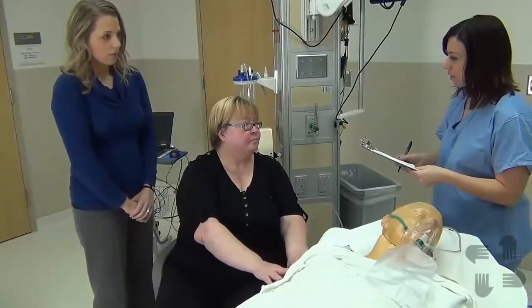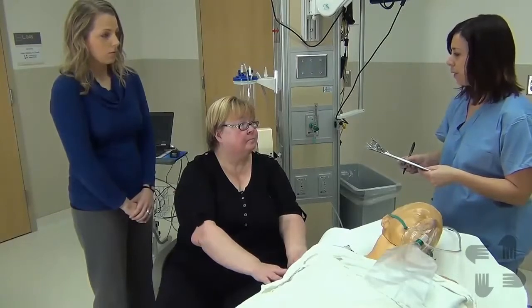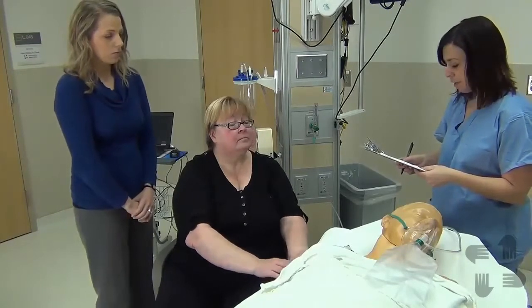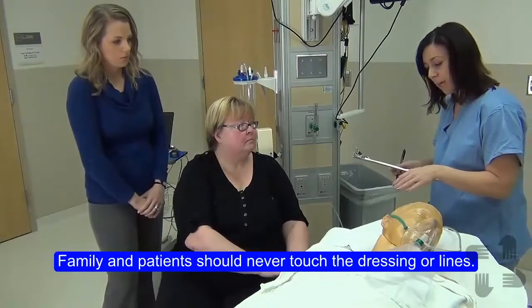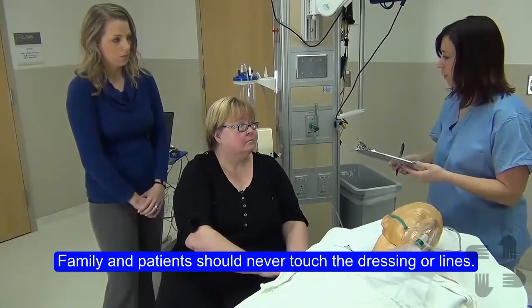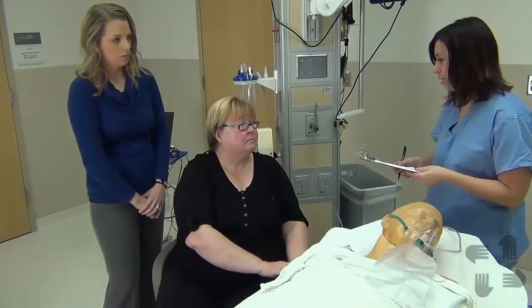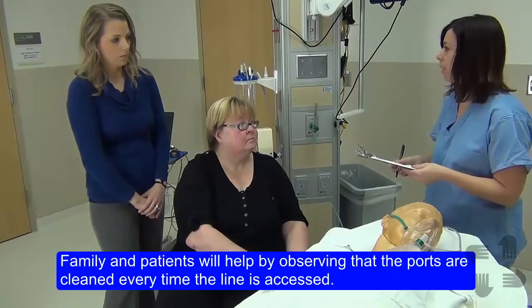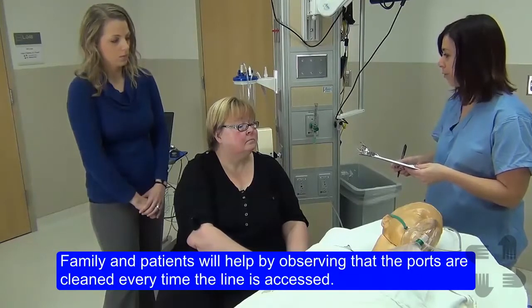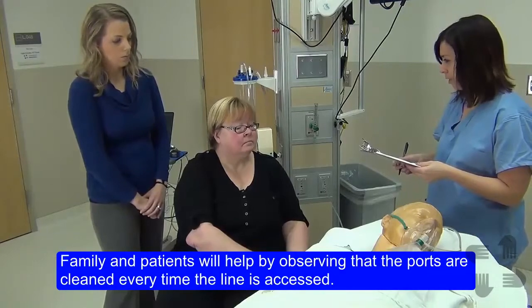Well, now that we've finished with the consent for George's line, I wanted to talk with you a little bit about what we're doing to help prevent infection with this line. And so first and foremost, after the line gets put in here on his neck, we'd like that all of the family members keep their hands away from it and actually not touch it. Our nurses, with fluids in, they're going to be putting an alcohol prep and a cleansing prep on there every time before entering the line so that we can help prevent infection. Any questions on that? Okay.